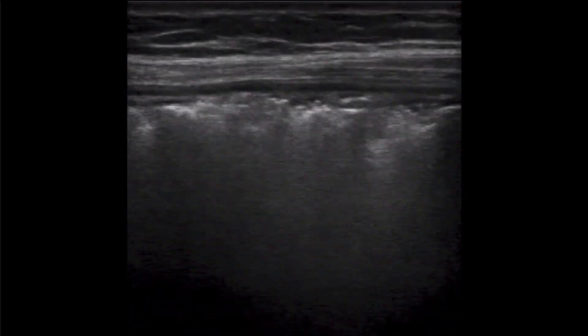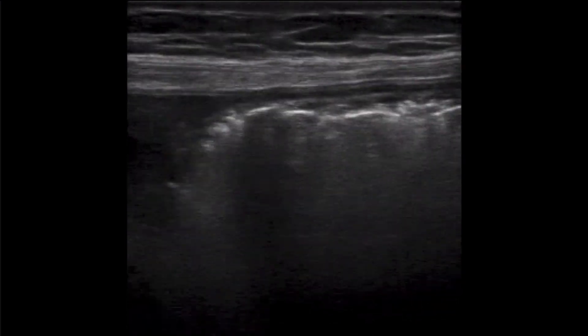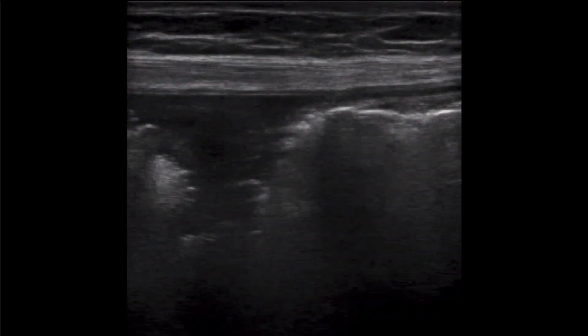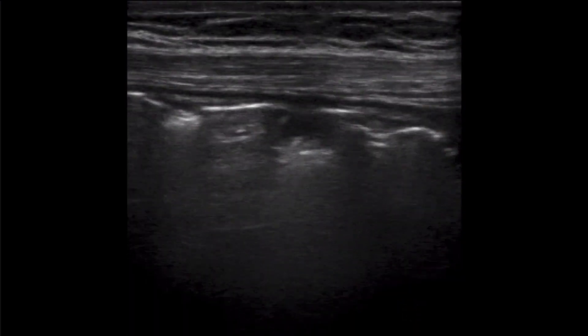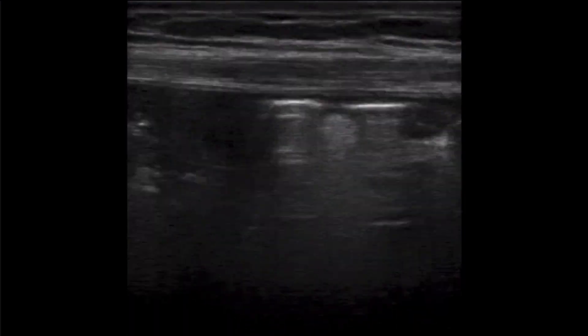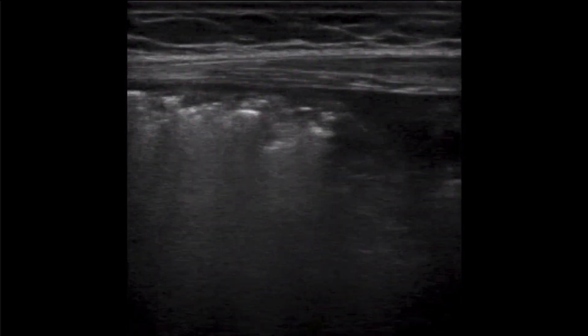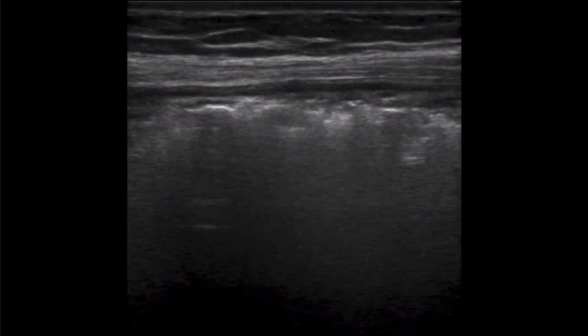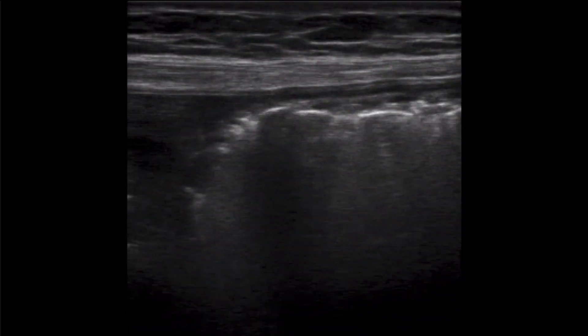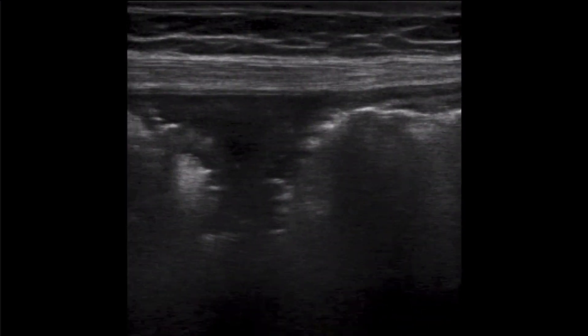The appearance of air within normal tissue is often referred to as dirty shadowing because the air in the tissue obscures visualization of structures deep to its presence. This air looks similar to our necrotizing fasciitis case discussed in the May 2021 case.